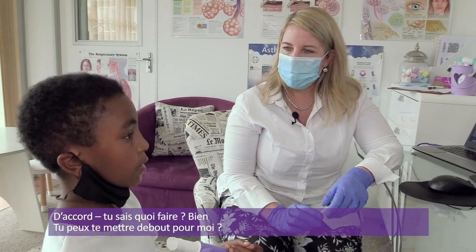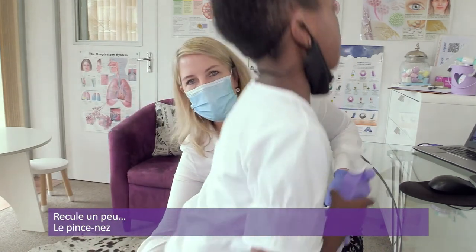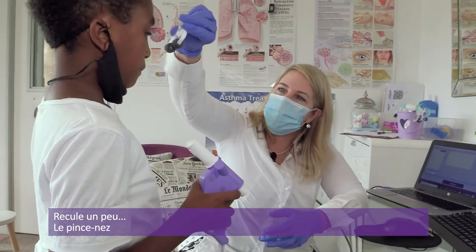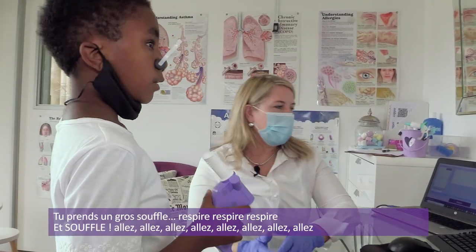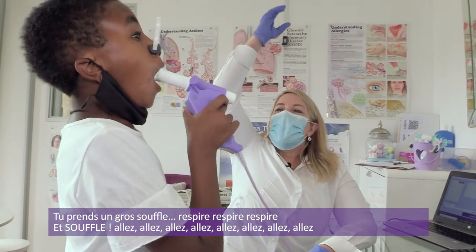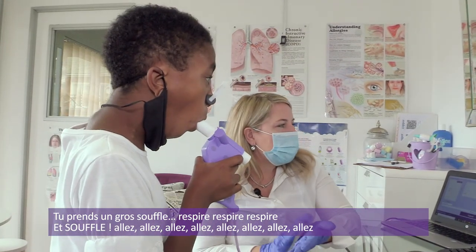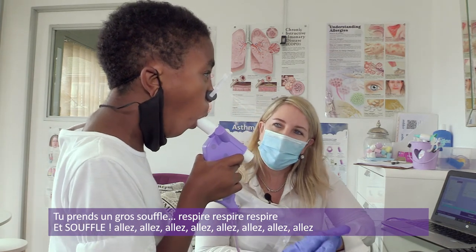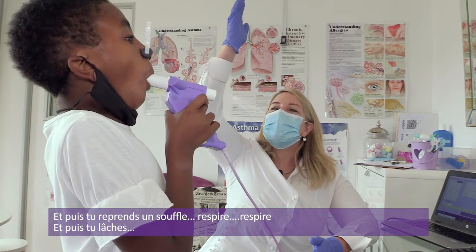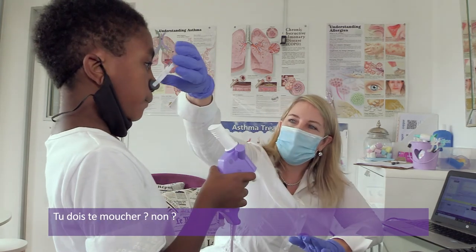Okay, so you know what to do. Right, can you stand up for me? I'm going to move your chair back a little bit. Move back a fraction. Right, okay, let's put your nose clips on. All right, and are you ready? Okay, take a deep breath in. Fast as you can. Go. And breathe in. In. And rest. Good. Well done.